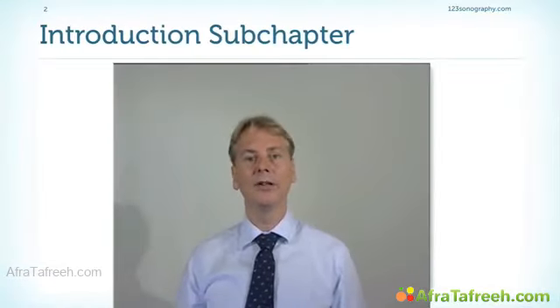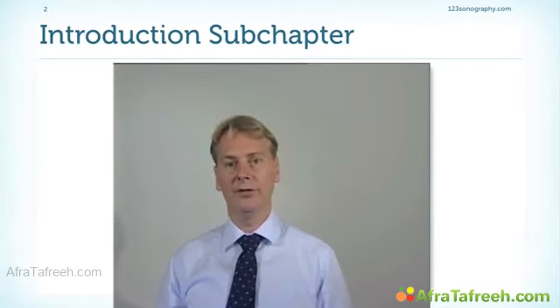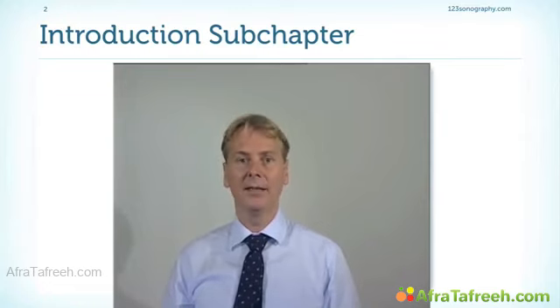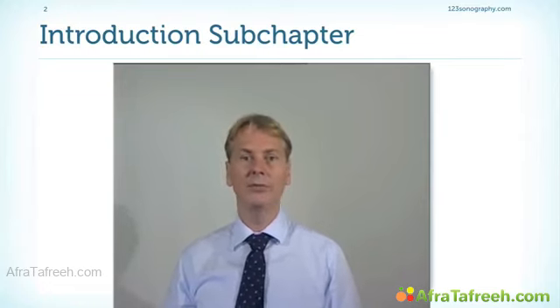M mode has certainly lost much of its importance in modern echocardiography. Still, M mode does have its application in a routine exam. Let's take a look where we still need M mode and where its importance is.